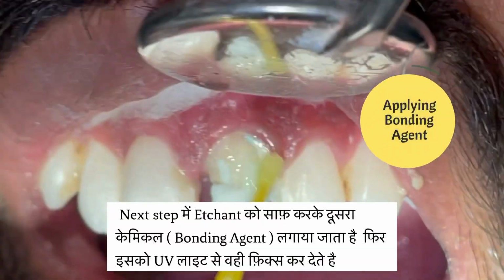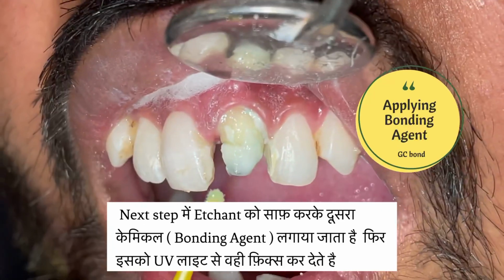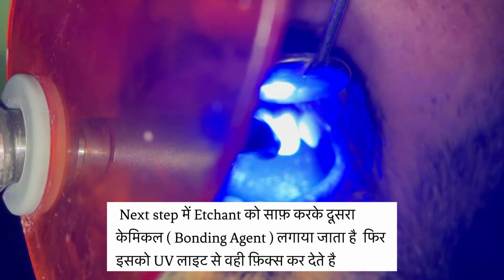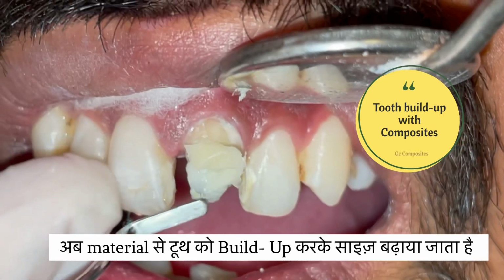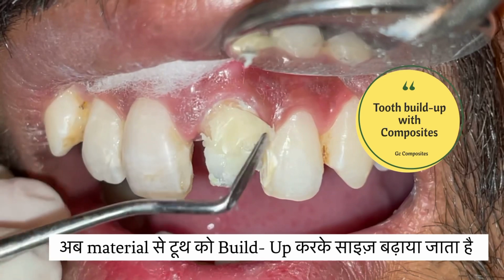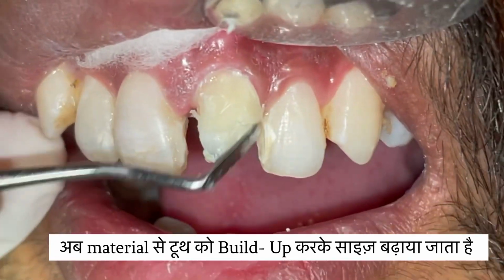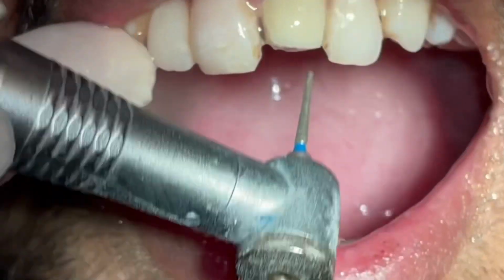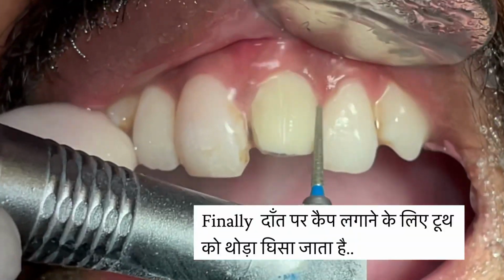In the next step, we'll proceed with another chemical agent called bonding agent on the tooth surface, which also increases the adaptability between the tooth and the composite material. And again, we'll use the same light cure gun to fix the bonding agent to the tooth surface. Now the tooth is gradually built up with the help of a composite material. Once the tooth buildup is completed, we prepare the tooth for the crown, commonly called a cap.